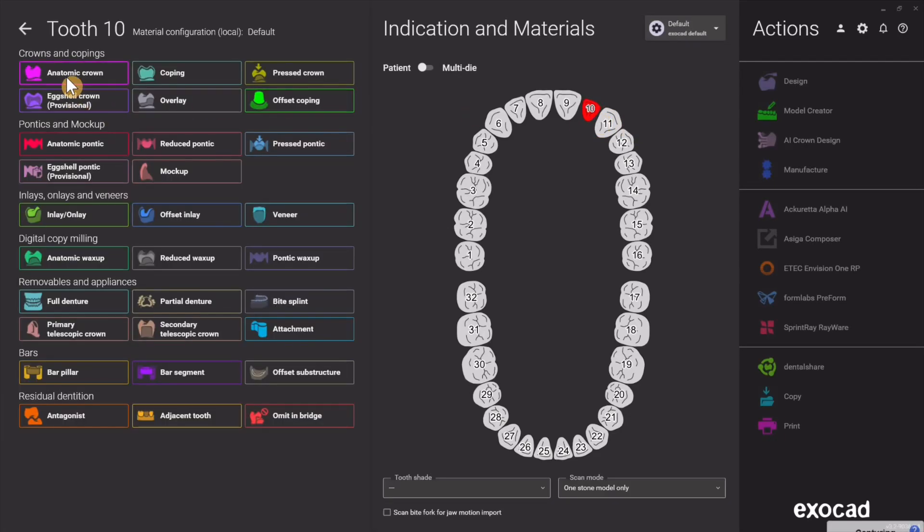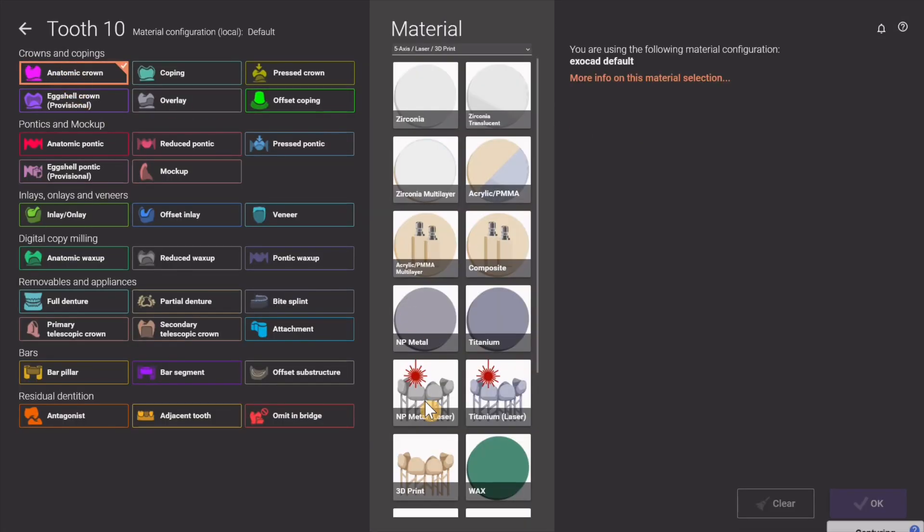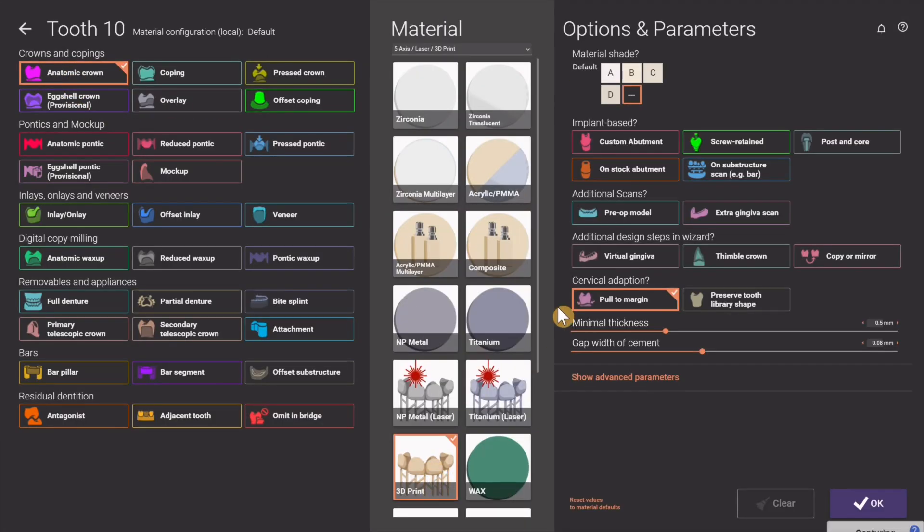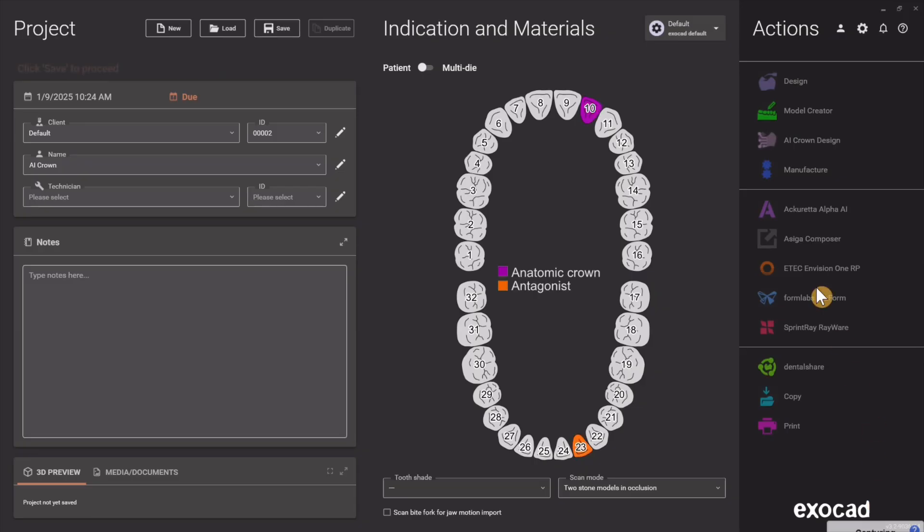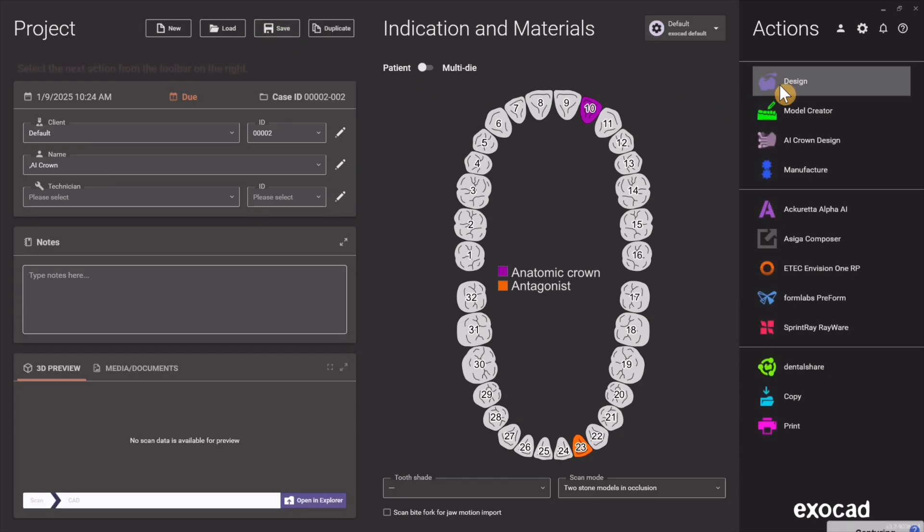Exocad AI Implant Crown Design. It's more like AI-assisted here. We're going to go ahead and hit Anatomic Crown Screw Retained and Scan Body Scan, then hit Save and then Design.